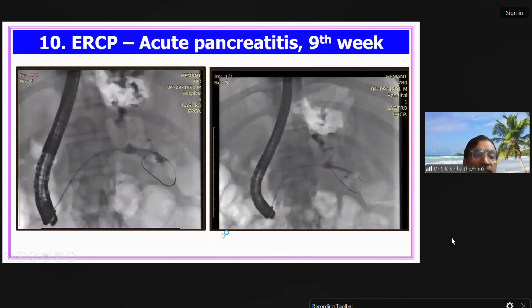So you can see the metal stent out here. Okay. And then this is the short scope position, and the wire is not crossing the duct and crossing the vertebra. So you know this is pancreatic duct anatomy. There is selective pancreatic duct cannulation which has been done, and then the guide wire is looping. So most likely it is in some sort of cavity, and the contrast you are seeing here is in a very irregular manner, and through the metal stent it is going into another area. So this is basically a cystogastrostomy, walled off necrosis, cystogastrostomy.